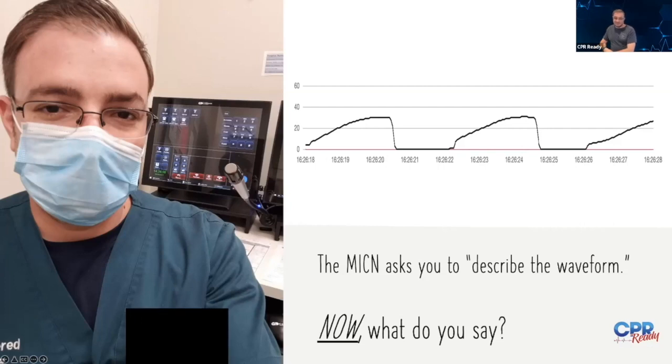Okay, shark fin. And what does it represent? You have somebody who's in respiratory distress. You see the shark fin. What's the most likely cause for it? Asthma, pneumonia. There we go. Asthma or COPD.